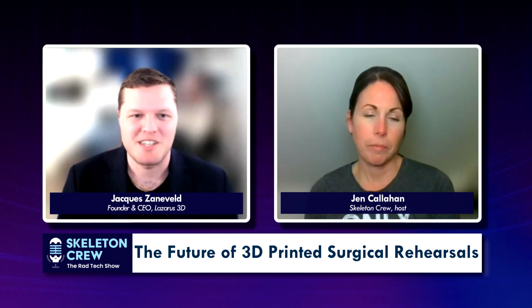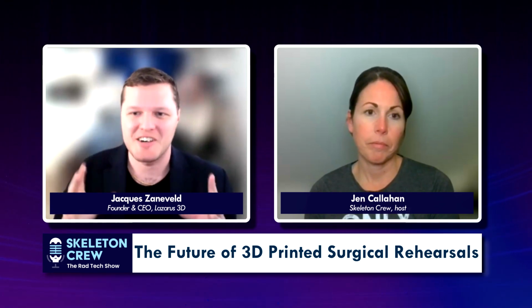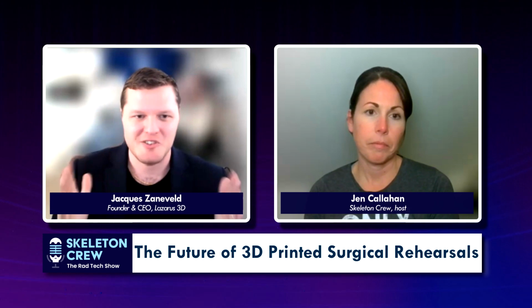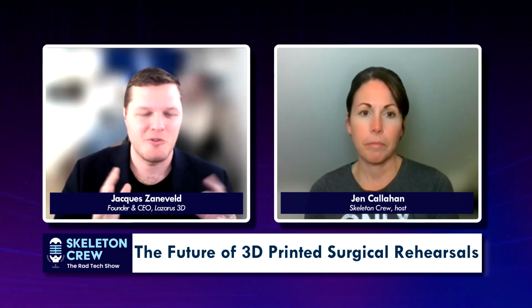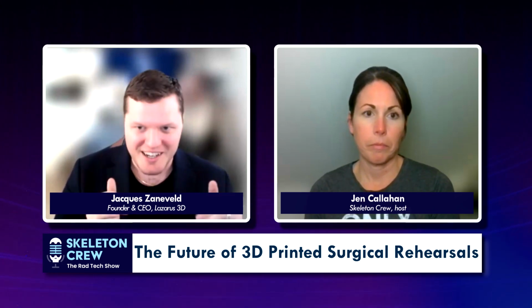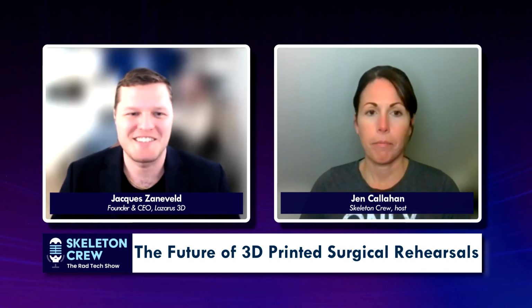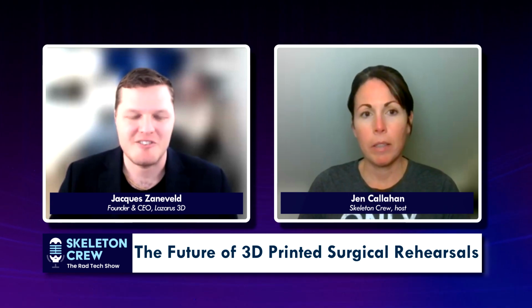The same thing happens with our models. So what we ended up doing, in a test of some of the bladders that we were building for the FDA to show how accurate we could be, we suspended the whole thing in a solution that was the exact same density as the model, so that it would stay in a totally neutral configuration. And then we could analyze that and show that, to within the acceptable tolerances, it matched the patient data that we had received. Wow, the sub-millimeter tolerances.